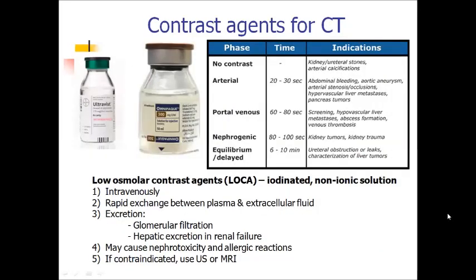Contrast agent for computed tomography. Usually a low osmolar, iodinated, non-ionic solution can help us in enhancing CT scans. They are administered intravenously.